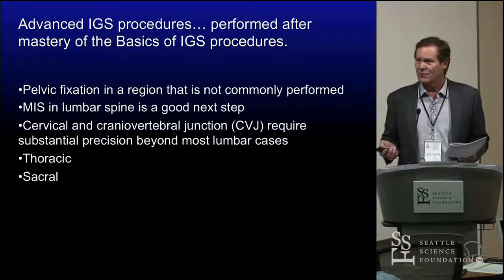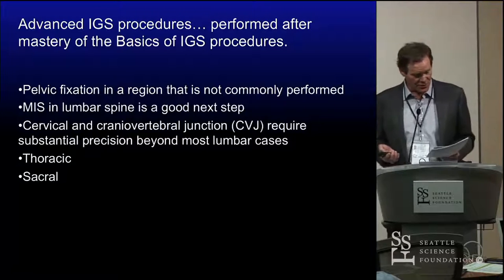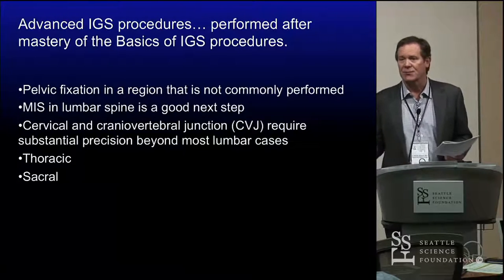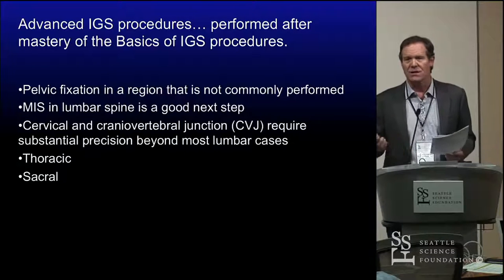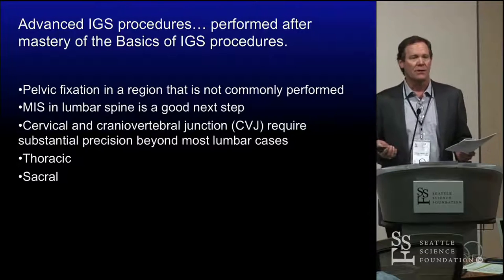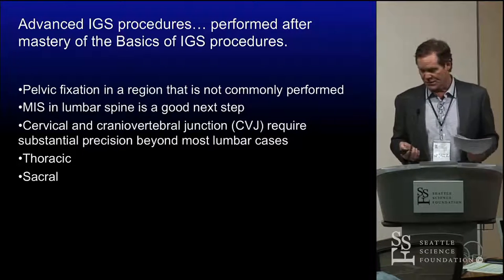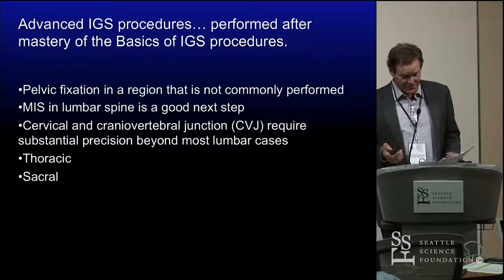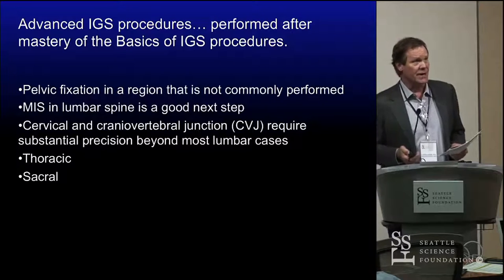In fact, I did one the other day. I amazed myself that it actually looked pretty good even though we didn't use image guidance. But that just comes down to experience. If you don't have the experience, you need the technology to do these things reliably. And we already heard, back in lecture number one this morning, about costs. It comes down to cost effectiveness. How many times do you want to take patients back to the operating room?